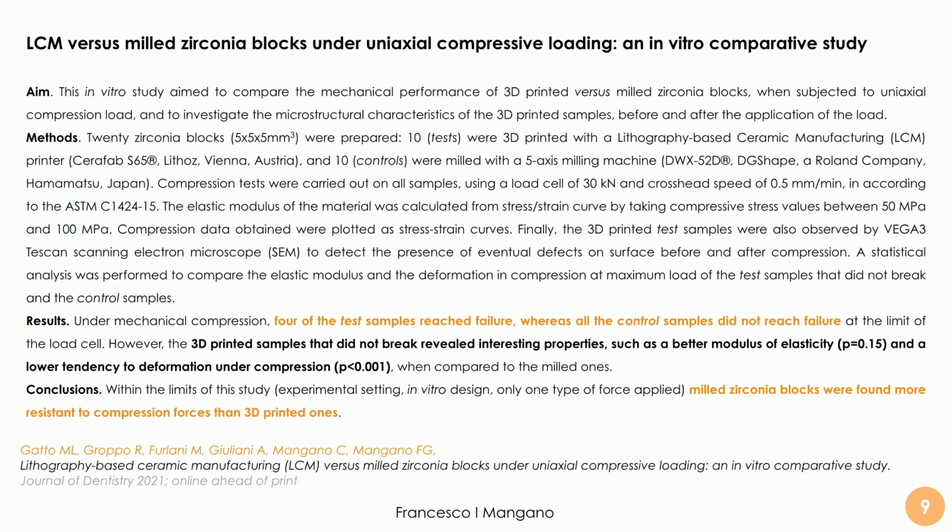But in our study, basically, we fabricated 20 zirconia blocks. 10 of them were 3D printed, the test blocks, and 10 of them were milled using a conventional milling unit, the one I have in my clinic, the Roland D52. And then we evaluated the behavior of these blocks under uniaxial compressive loading using the state-of-the-art test in this in vitro comparative study.